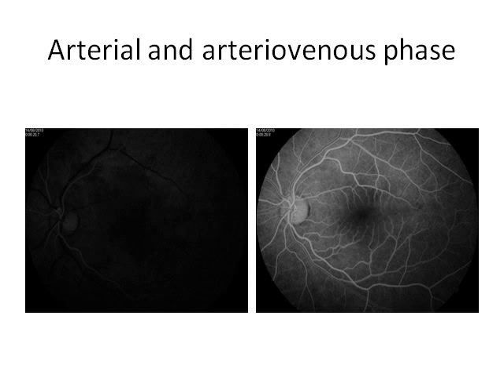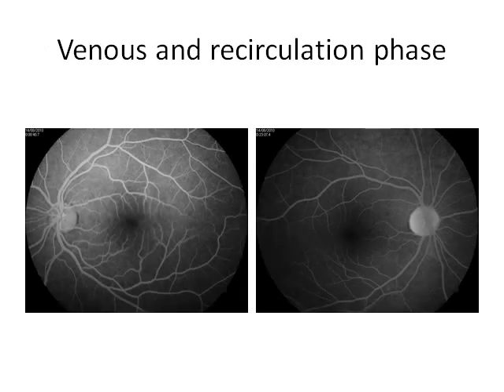In the next 5 to 10 seconds, fluorescence of the two parallel laminae becomes thicker. As the fluorescence filling increases in the veins, the laminae enlarge and meet, resulting in complete fluorescence of the retinal veins. Fluorescence of the disc emanates from the posterior ciliary vascular system, both from the edge of the disc and from the tissue between the center and circumference of the disc. The healthy disc tissue contains many capillaries and the disc becomes fairly hyperfluorescent on the angiogram.